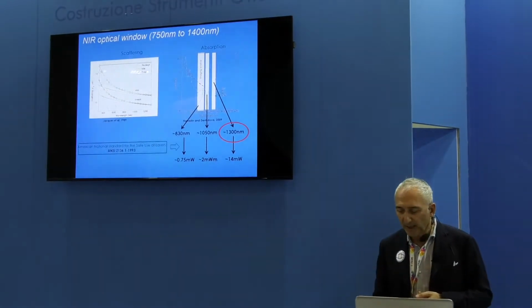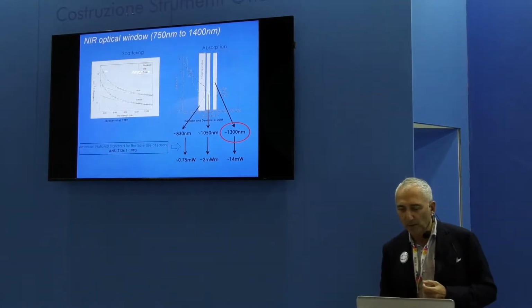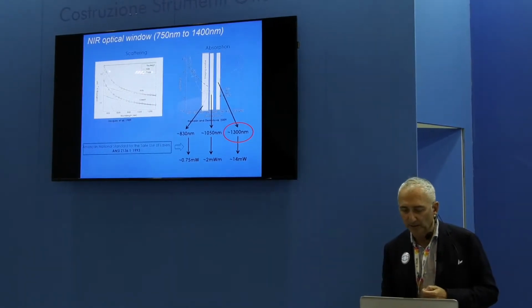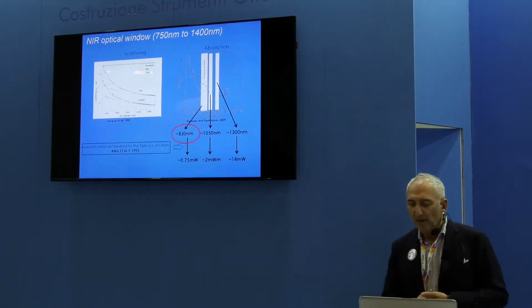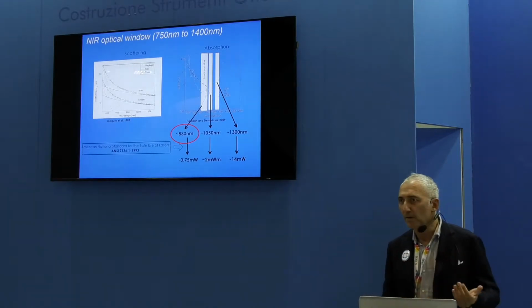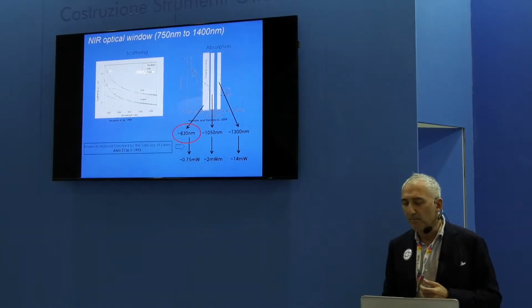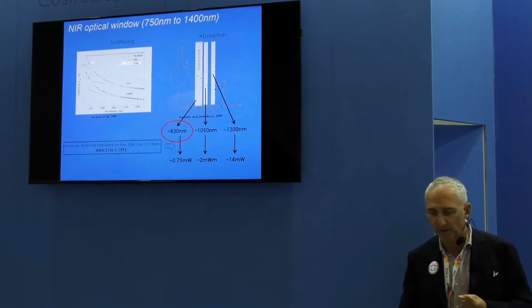But 1300 nanometers is not the only possibility when we consider the good wavelength for analyzing a biological tissue. There are others. If we move to around 830 nanometers, the wavelength that most retinal OCTs use, we have some differences, and I believe for our purposes some advantages.